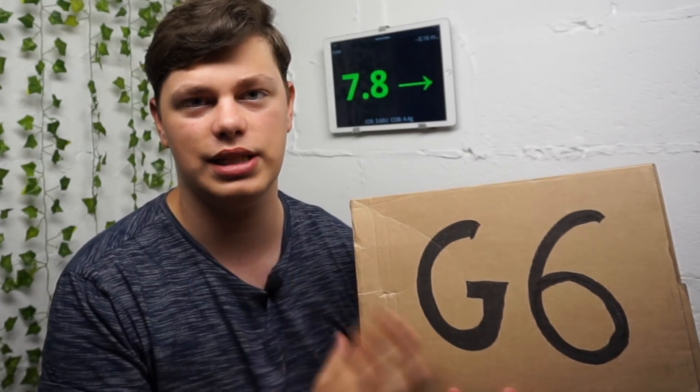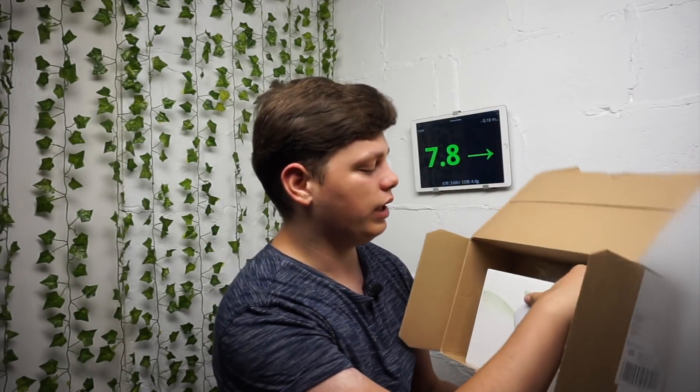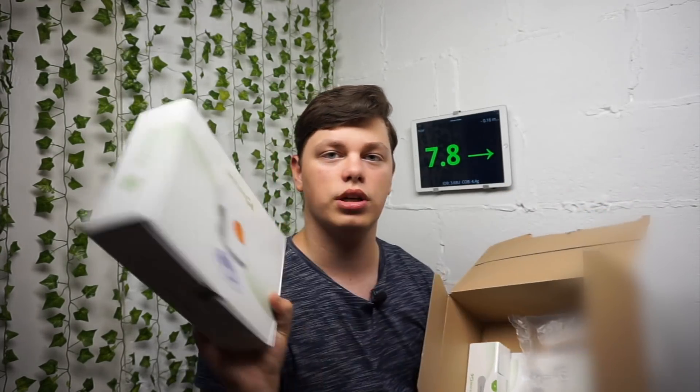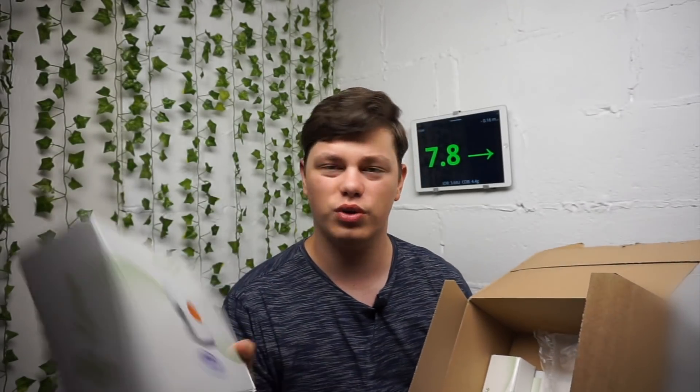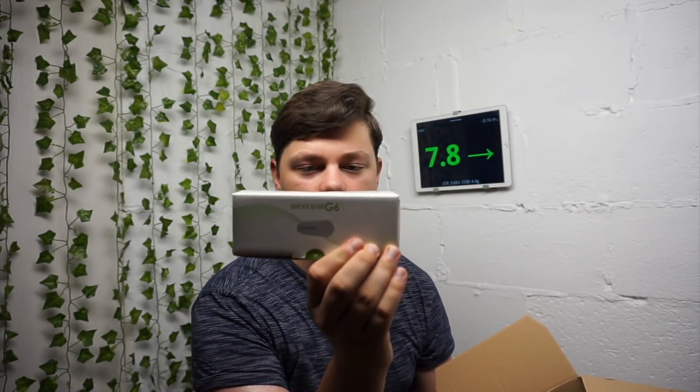In the UK the starter pack is 159 pounds, and that includes a box like this. The starter pack includes three sensors — one sensor lasts for 10 days, so that's about 30 days worth of sensors. I am planning to extend my Dexcom to use six sensors and hoping to get at least 15 to 20 days out of each sensor. You also get the transmitter, and that one transmitter lasts for three months.